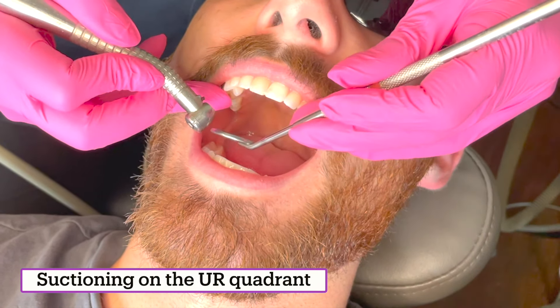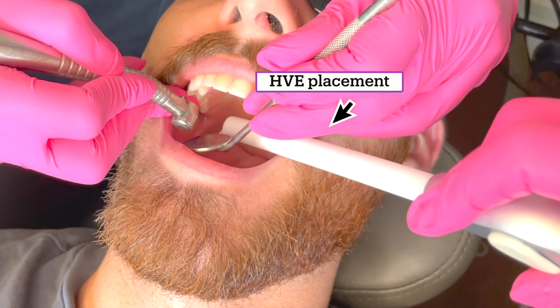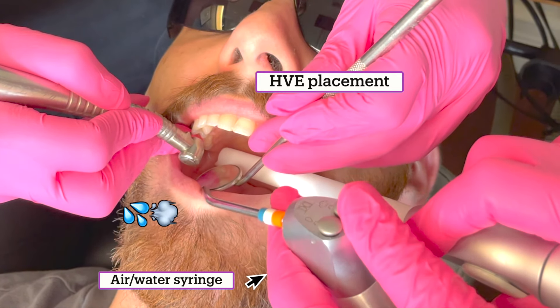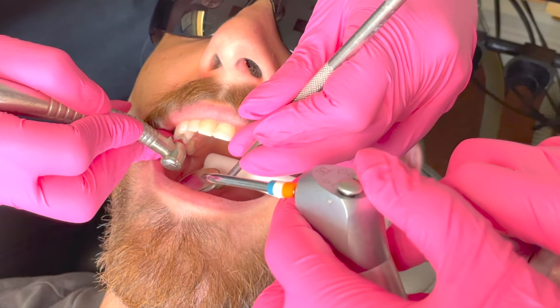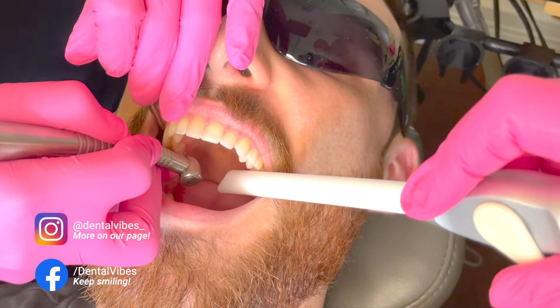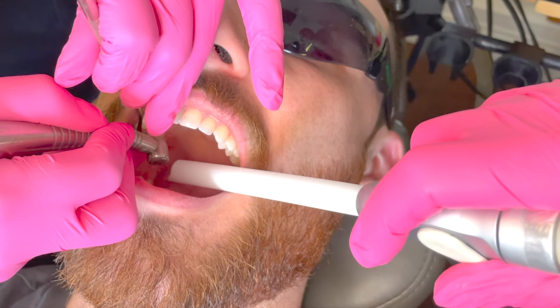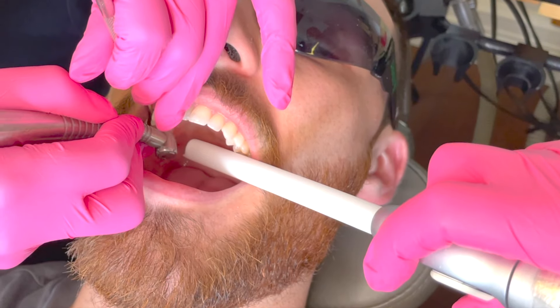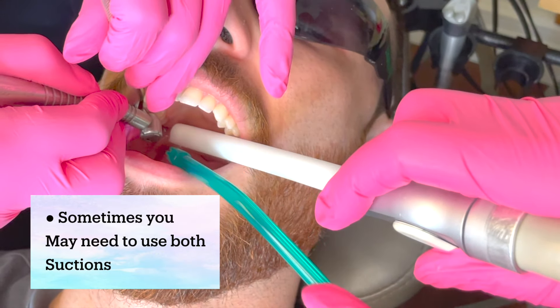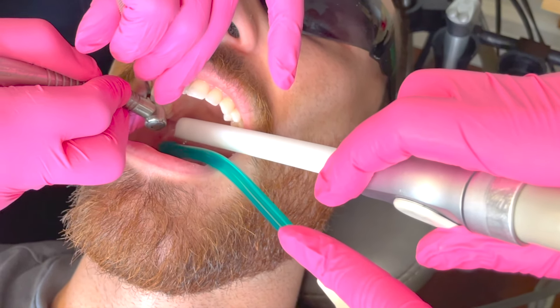Now we're moving to the upper right. You're going to bring your suction all the way to the back, and the mirror at this point will start fogging up because there's water and the patient is breathing. So you're going to go in and spray air to unfog the mirror. Sometimes the doctor will come and block your view a little bit — in that case, this area is pretty easy to get to. If there's a lot of water coming, sometimes you need both the high suction and the saliva ejector, because depending on how much water is coming down, one is not going to be enough.